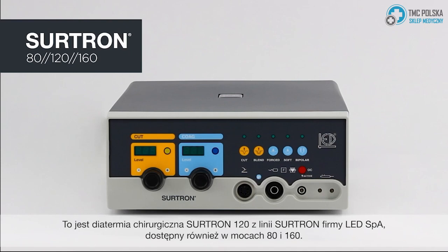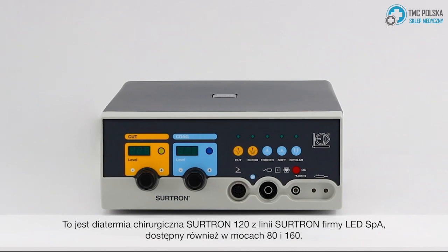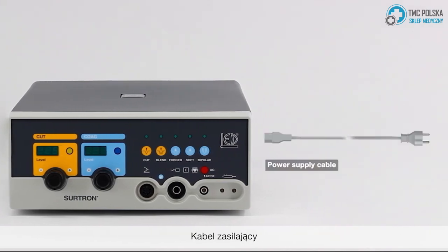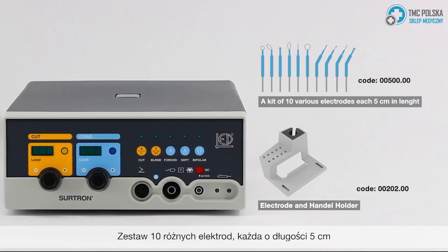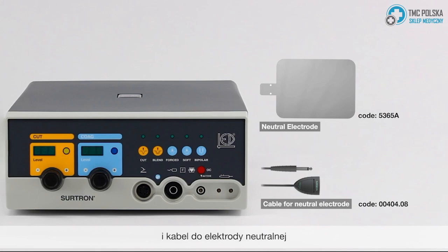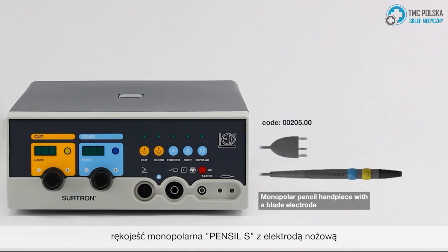This is the Surtron 120 Electro-Surgical Unit from LEDSPA Surtron Line, also available in powers 80 and 160. The unit comes with the following: a power supply cable, a kit of 10 various electrodes 5 centimeters each in length, an electrode and handle holder, a neutral electrode and the cable for the neutral electrode, a single petal waterproof foot switch, and a monopolar pencil handpiece with a blade electrode.